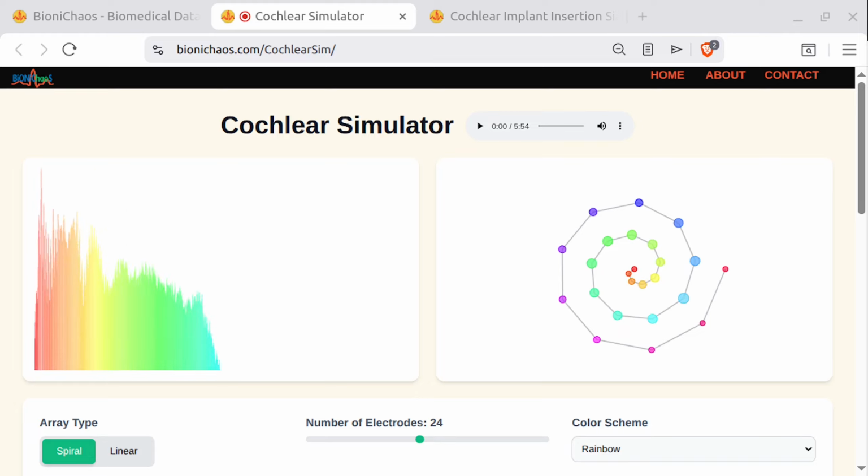Look, device failures are devastating, I won't argue that, but they represent a small minority of cases, and our diagnostic abilities to detect soft failures early by measuring impedance telemetry. Impedance telemetry. Yeah, basically checking the electrical resistance of each individual electrode contact. That technology has improved dramatically. We can catch issues before they become hard failures.